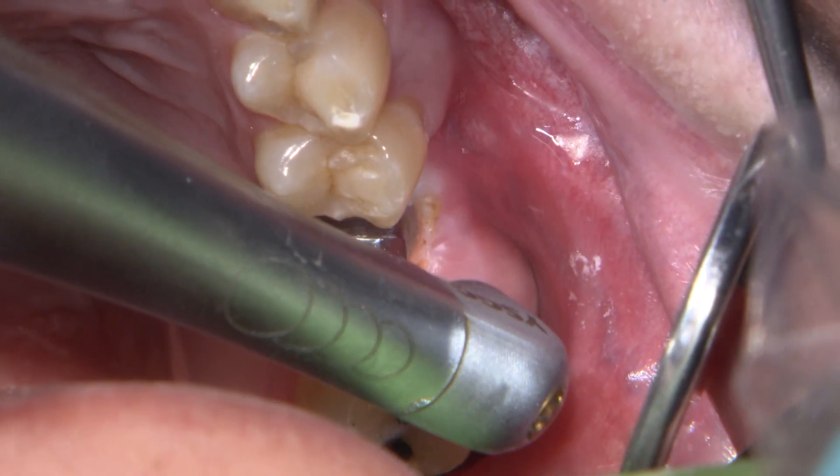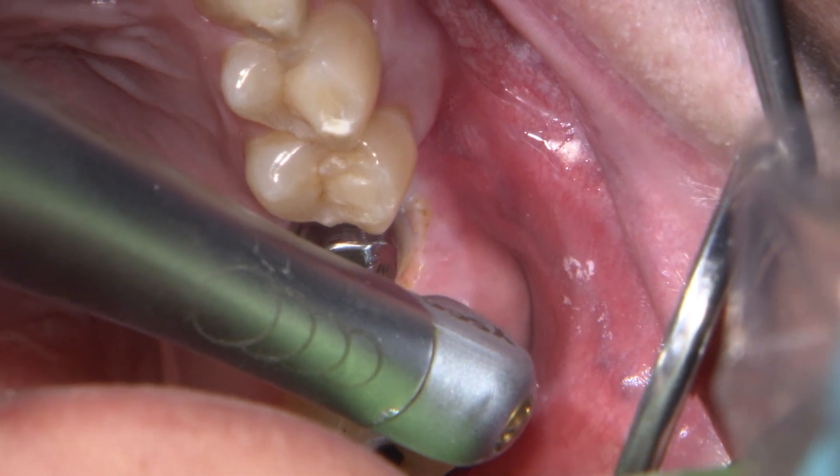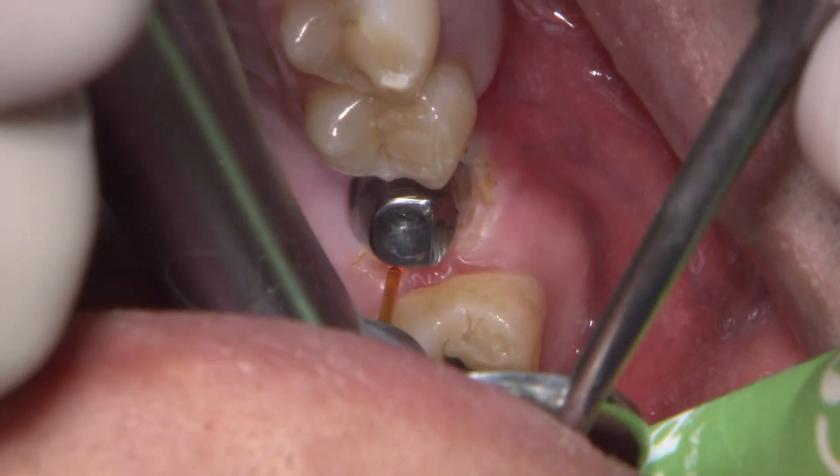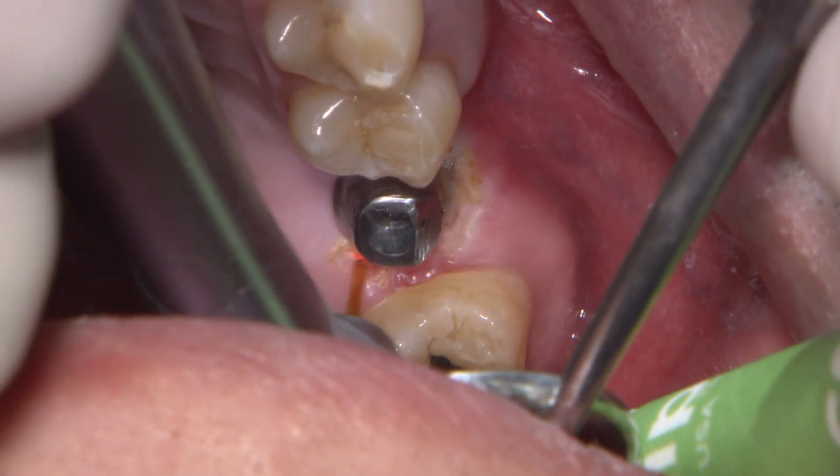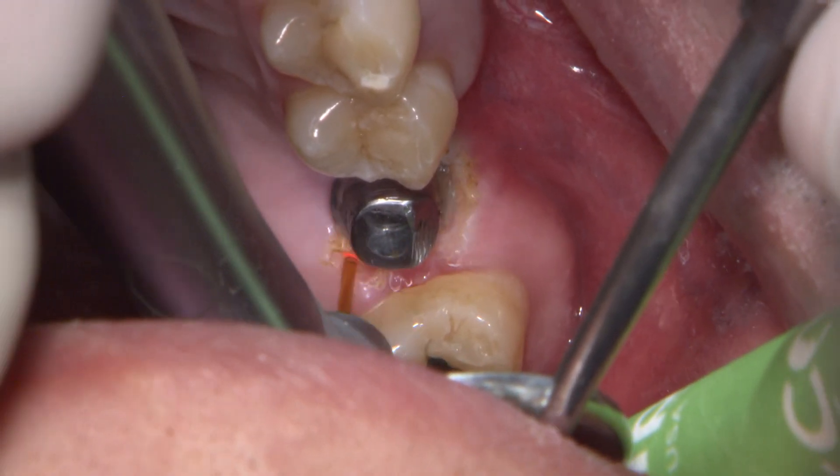In this example, soft tissue is covering the margins circumferentially. If I move forward with the digital impression, the lab is unable to fabricate a restoration that sits flush to the edges of the abutment.